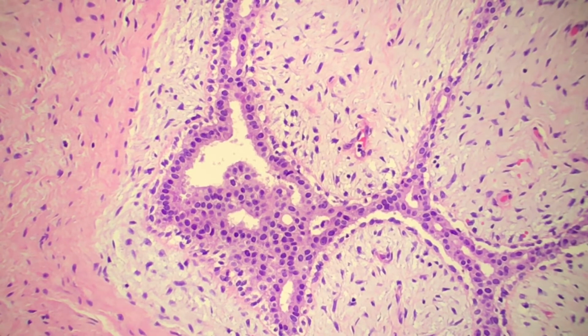So you have glandular and stromal components that look like fibroadenoma, but there's no actual mass lesion. That's fibroadenomatous change when we say that. You can also think about pseudoangiomatous stromal hyperplasia, or PASH, tubular adenomas within the breast, as well as fibrous tumors. But really, phyllodes and fibroadenomatous change are your big hits for your differential with these cases.